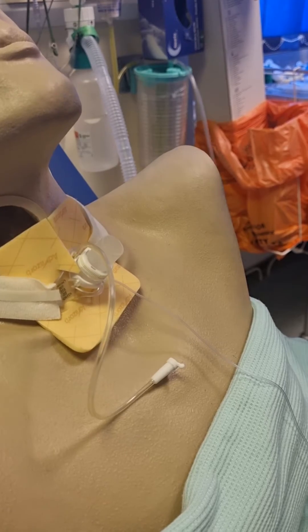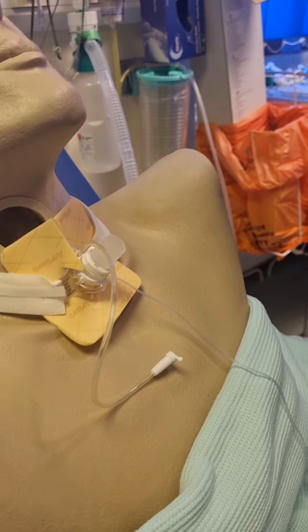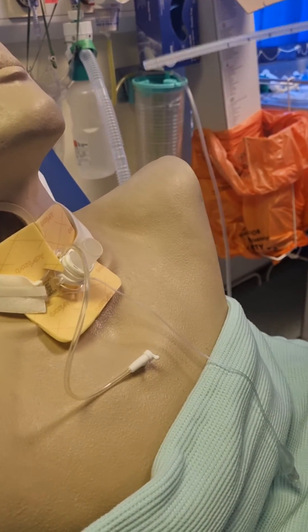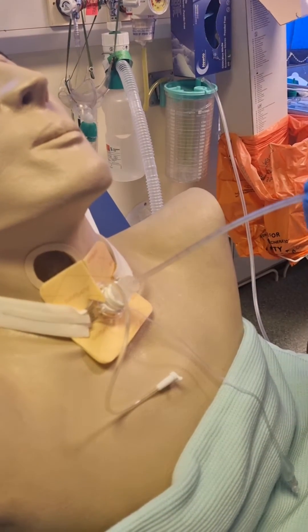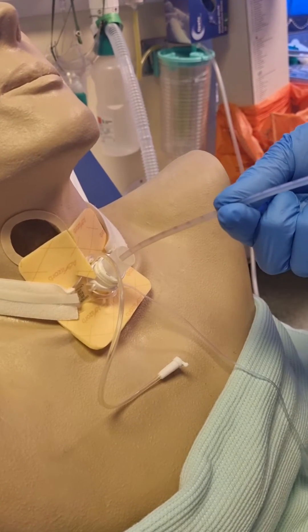To provide suction, ensure that you have one clean hand, which is the double-gloved hand, which only touches the clean catheter. Tell the patient you are about to suction and that they should have a big cough when the suction catheter stimulates the cough reflex.